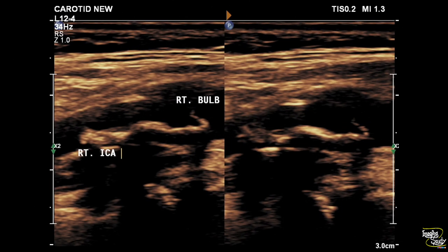Here's the proximal internal carotid artery with the carotid bulb. You can see an irregular, predominantly echogenic and calcified plaque causing luminal narrowing at this point.